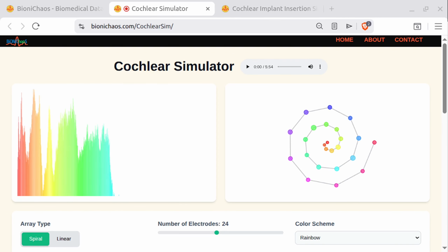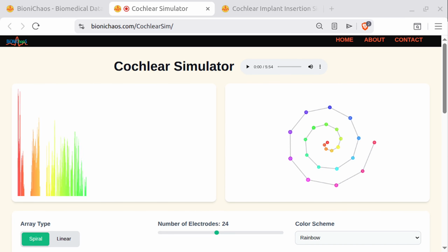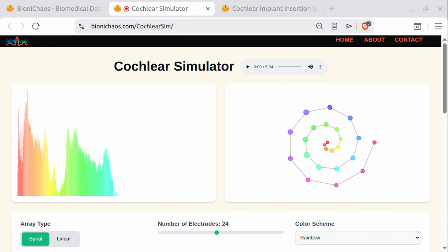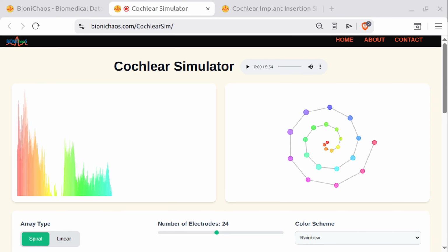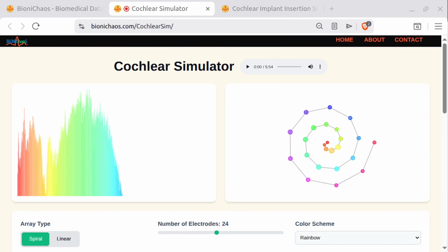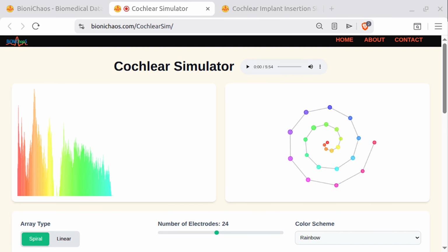And the patient perspective doesn't deny that human connection at all, but it insists that the clinical data is only half the story. Right. The daily reality involves managing chronic nerve pain, unpredictable loss of taste, the terrifying vertigo that strips away their physical independence, and the profound psychological vulnerability of sudden device malfunctions. The cochlear implant is an undeniable engineering marvel, but it is an incredibly complex, lifelong physical and emotional burden. It is not the clean, frictionless cure that a 95% surgical success rate implies.